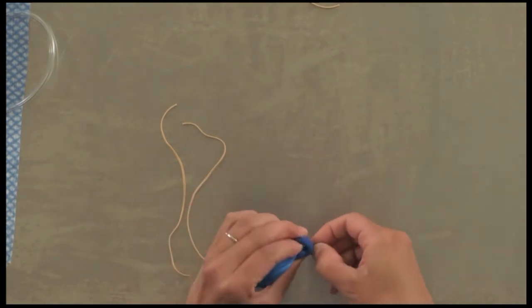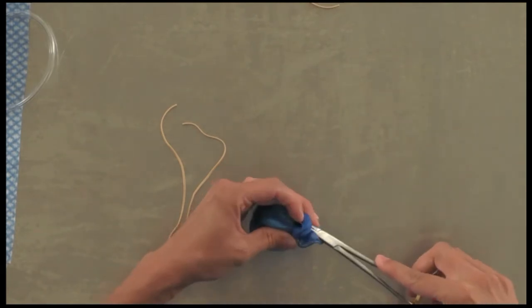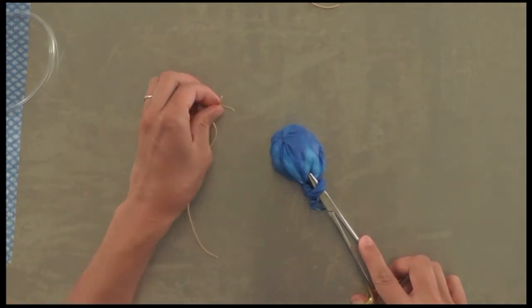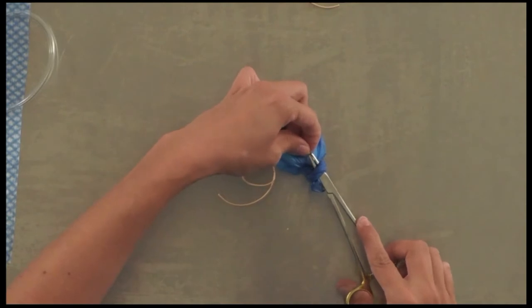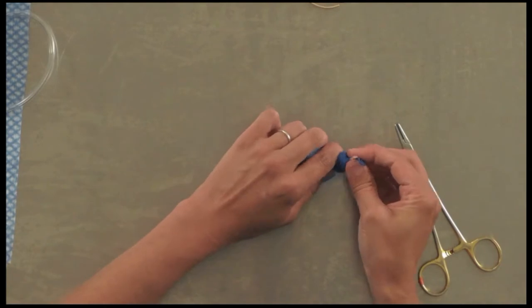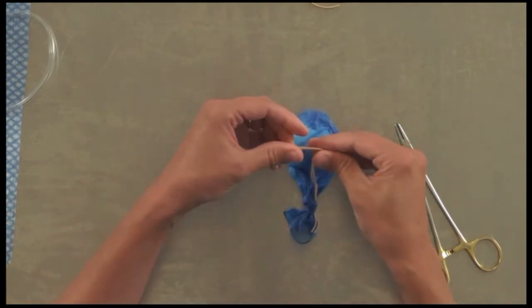Tie a loose knot — don't tighten it — and then use a pair of needle drivers or hemostats to grasp the two ends of the ureters, pull them through that loose knot, and then tighten it down. There we've got our bladder set up and ready.